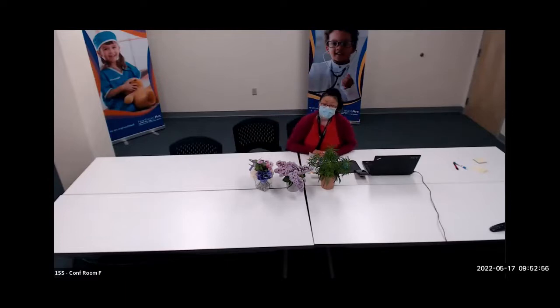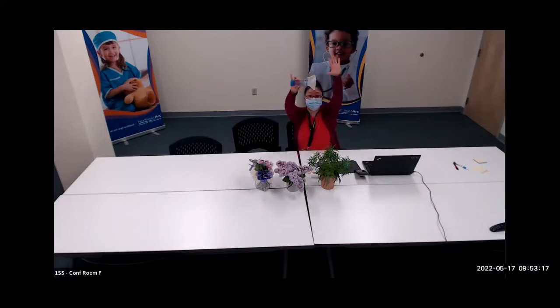So it is a good idea every week to rinse out and wash your spacers and inhalers if possible. You know, they can get a lot of gunk in them. They can get saliva in them, especially if you're using the mask. And I just wanted to mention that these do come apart. So this is an AeroChamber that you might see at home.